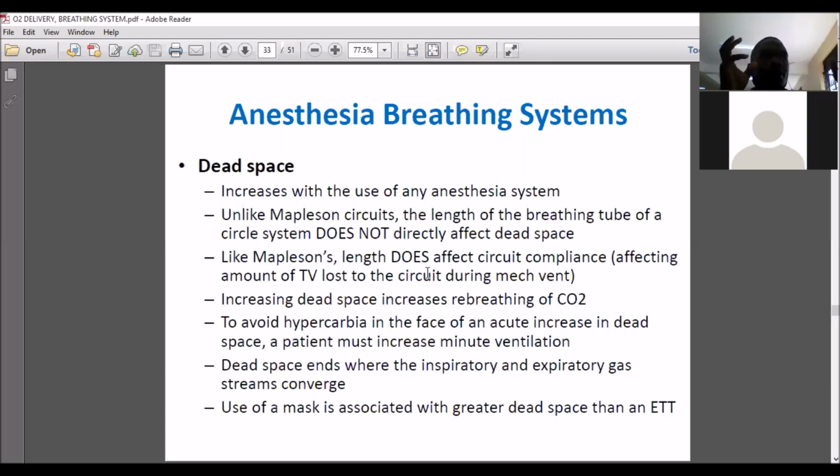Okay, so the dead space, you have to look at it in perspective of the patient alone, no system. No, but that one you have to, because if you had a distributor with beds that are far, you would give them more oxygen compared to nearer beds because of that distance. That one you have to for the oxygen delivery.